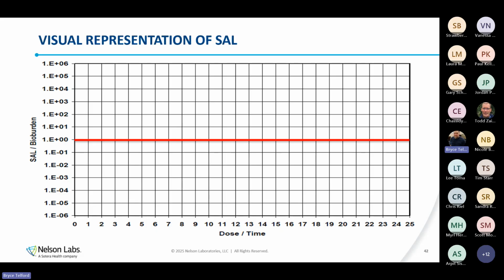So we have our baseline here, and VDmax 25, for example, we start and we have a limit of 1,000 CFU. We're trying to get down to 25 kilogray. So we have kind of our verification dose, which, for example, is kind of going to be somewhere around here.